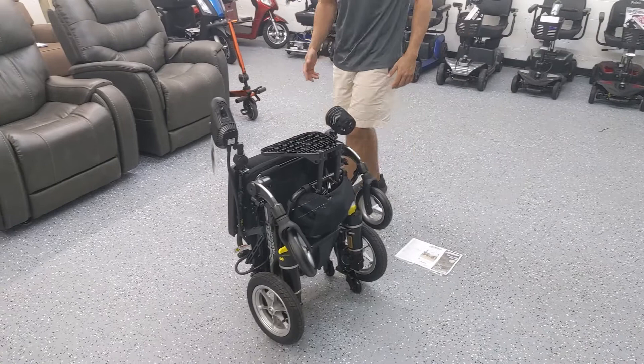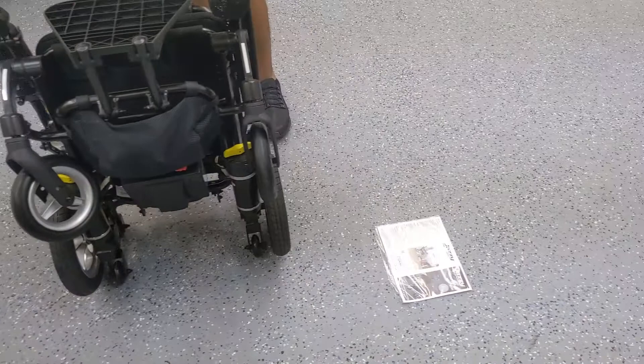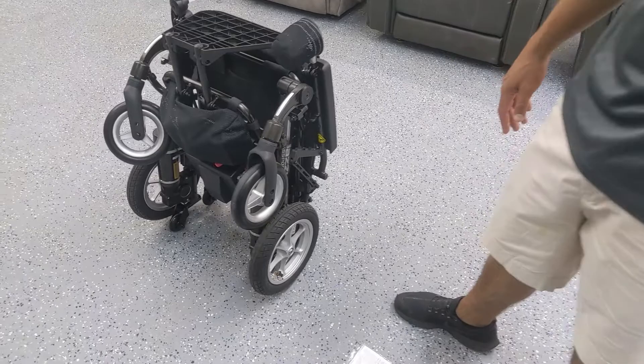At this point it's pretty transportable. It weighs about 57 pounds with the battery. The battery weighs 7 pounds, so if you take the battery out it's going to save you a little bit of weight. You can pretty much put this in the trunk of most sedans, definitely SUVs and trucks.